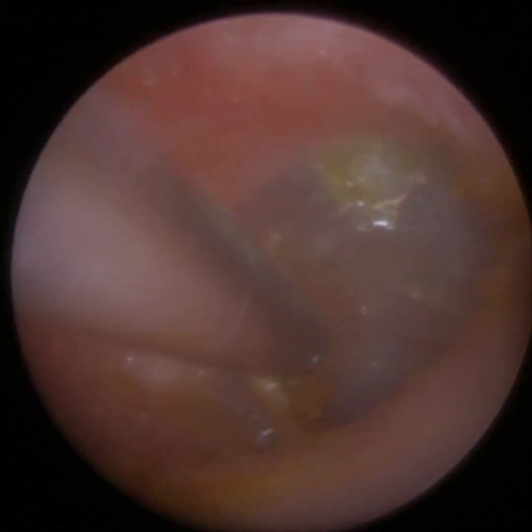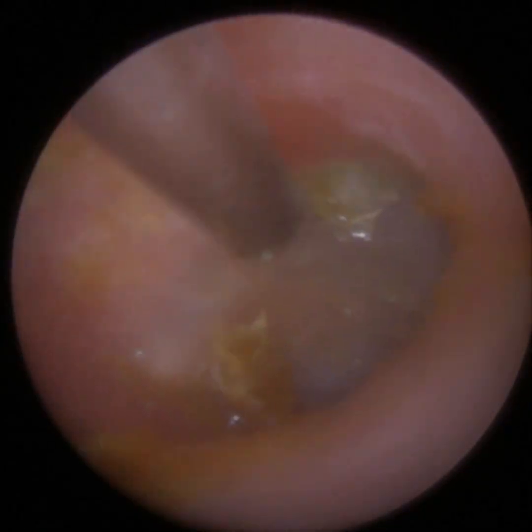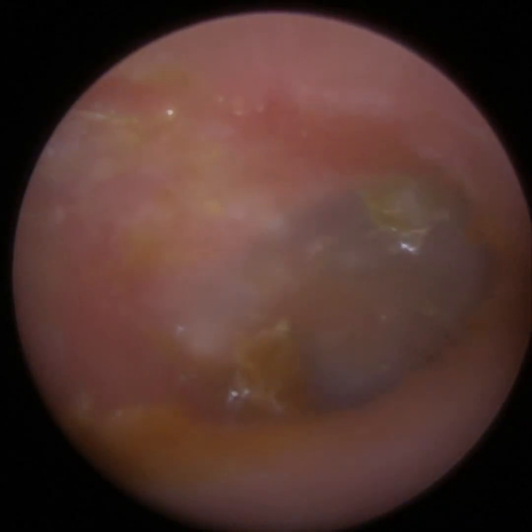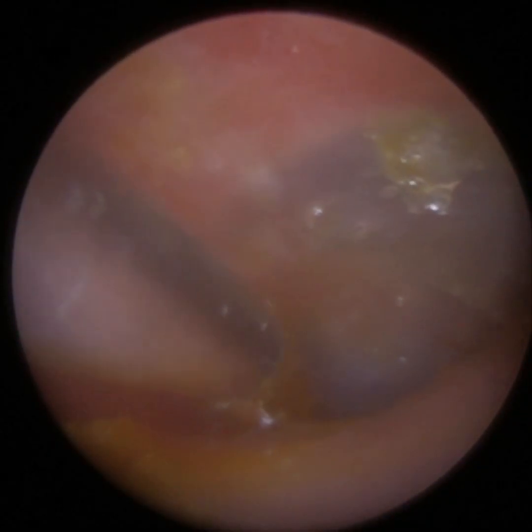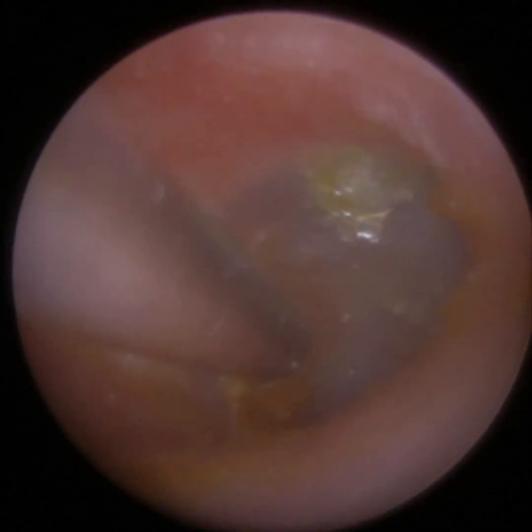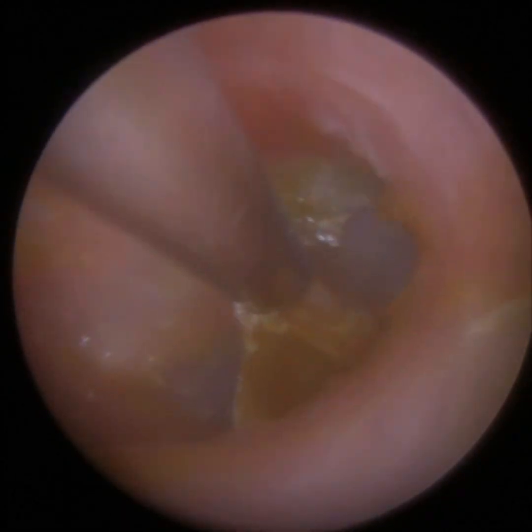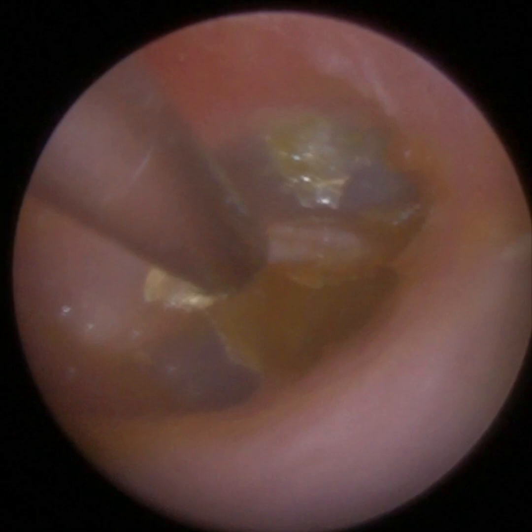You can actually probably see that just to the left where the suction tip is. You can see the ear canal goes in and it goes back out again. And that creates a recess, and it's typically two recesses. One to the left-hand side of the ear canal, in the case of the left ear. We call that the anterior recess. Anterior means to the front. So in the case of the left ear, the left-hand side of the ear canal is to the front, so it goes towards the nose, whereas the right-hand side is posterior, that goes to the back.